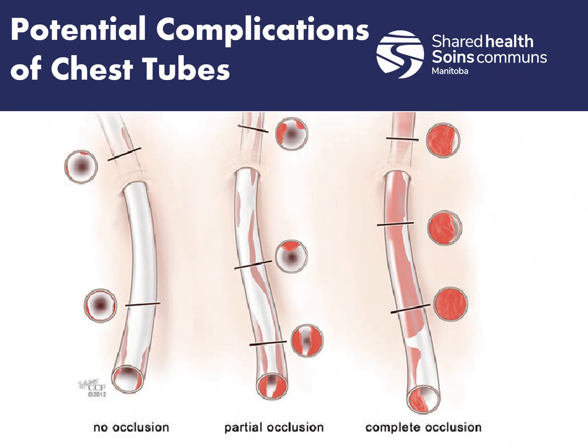But the big thing is that if there's a big clot there, we're not going to fix that. So that's something of note. Again, this is something to check before we transport our patient. If we notice that there's a lot of dependent loops, or it looks like there's a lot of blockage going on, we might want to change our tubing before we leave the facility.